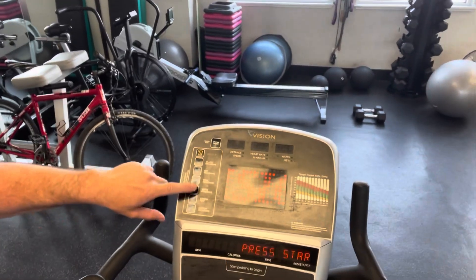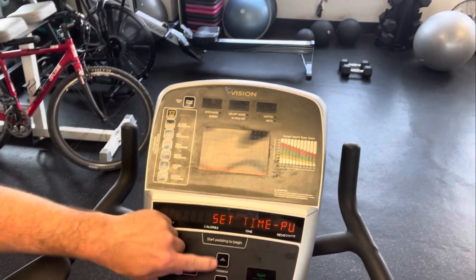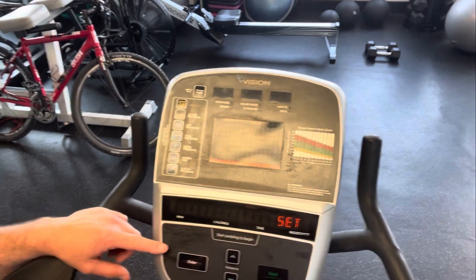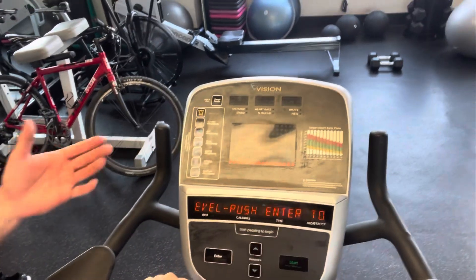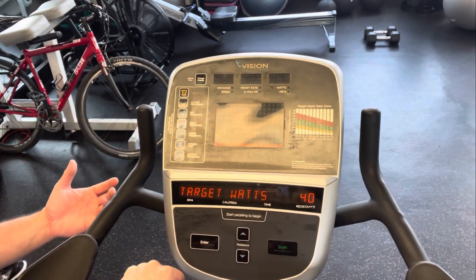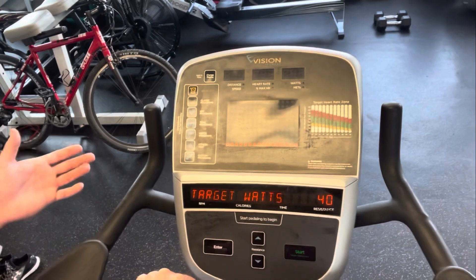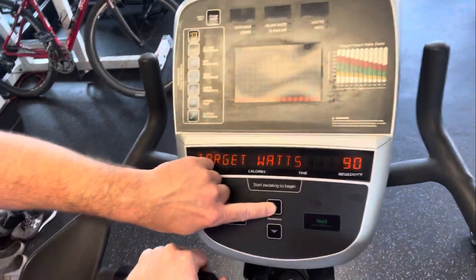This is a VO2 submaximal test. First, pick the wattage program — hit watts, enter, enter, enter. You're going to set the time; it's a 12-minute test. Then select your weight (doesn't matter) and then wattage. For this test, you're picking the wattage based on what you think they can do to get their heart rate above 120 beats per minute. For elderly or less fit clients, maybe 75 watts; a bit more fit, start at 100 or 125.